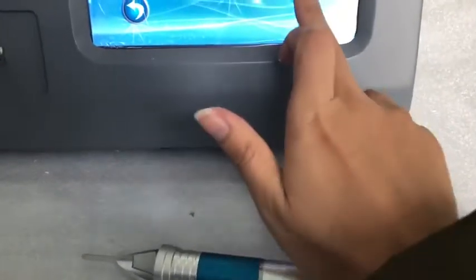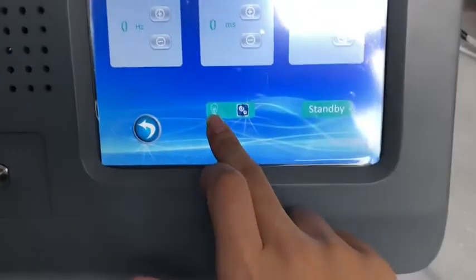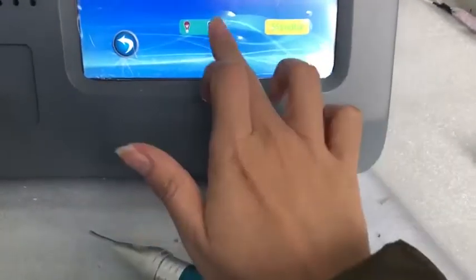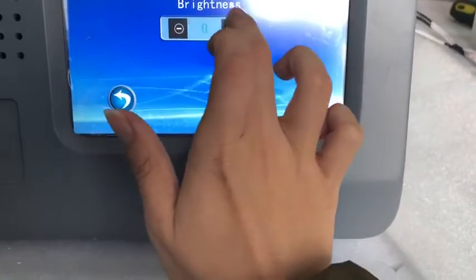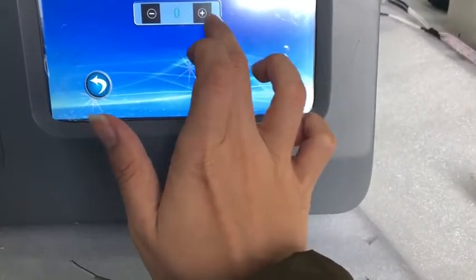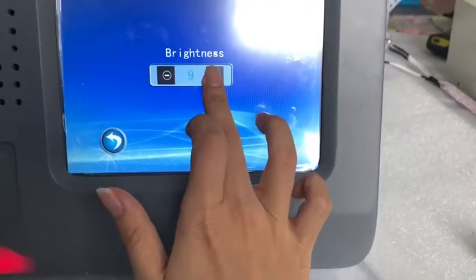No red. First turn on this — still no red. So we should adjust the redness. Red brightness is zero; we must make this eight, nine.